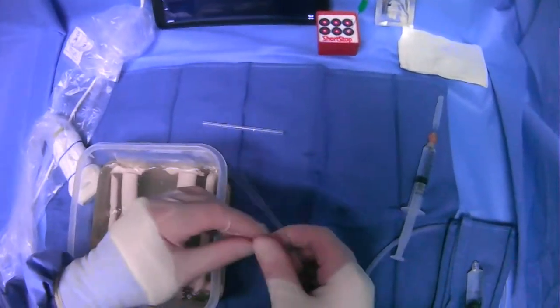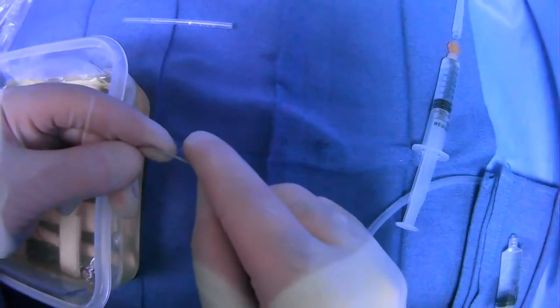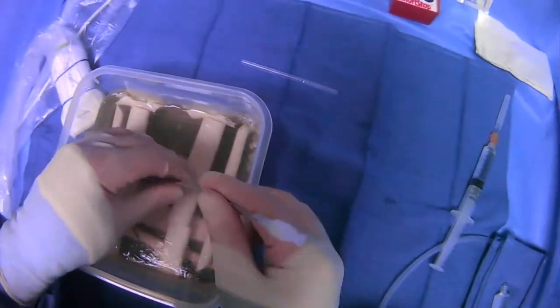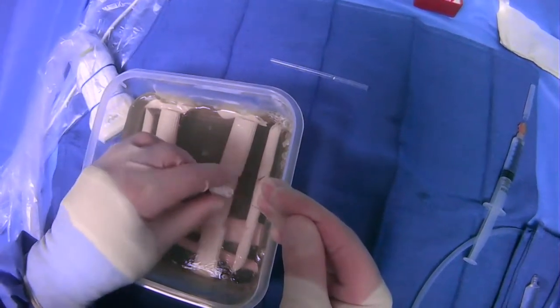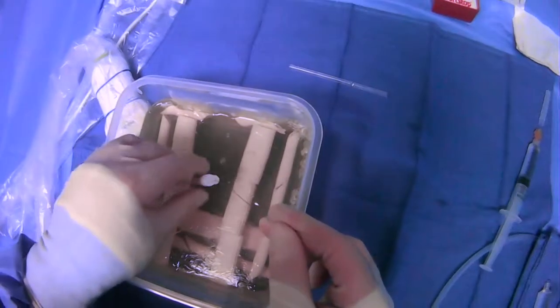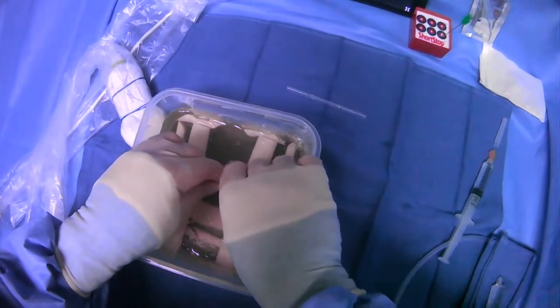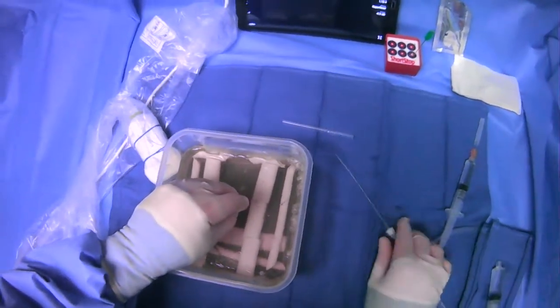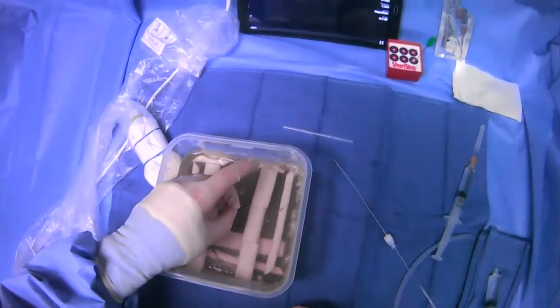Then we can get our microcatheter and just put it on. Grab the wire from the back, and push the microcatheter in over the wire. We can kind of hub it, and at this point what we'll do is unscrew and take out the inner stylet and the microwire, and we have access. We can now put another wire in and exchange the microcatheter off.